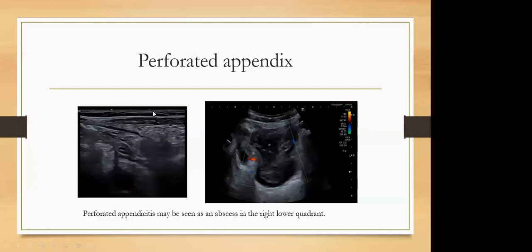This is using the linear probe. You change the probe to curvilinear low frequency. You see all this collection here. The patient was having pain for more than 7 days.